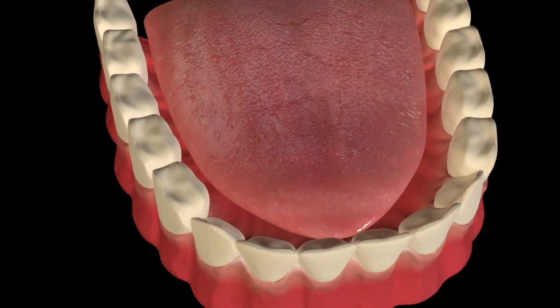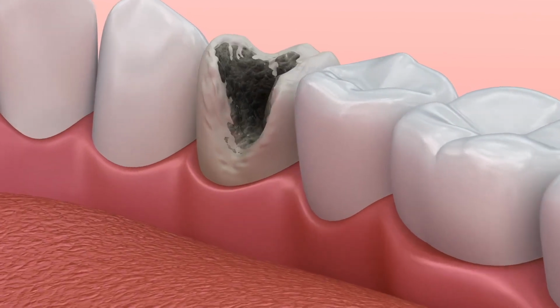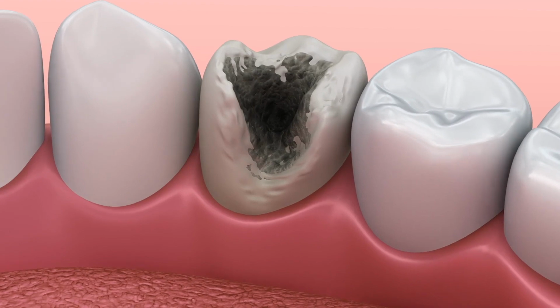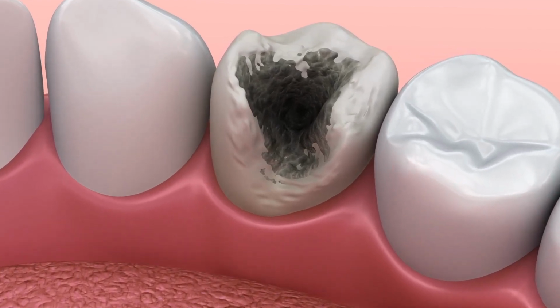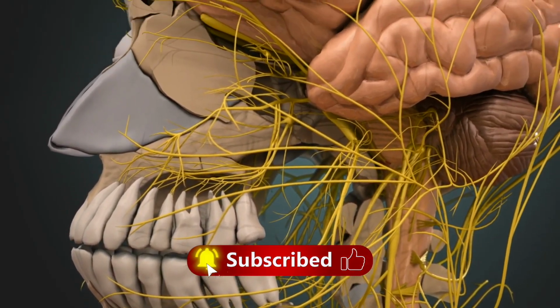There are several options for filling materials, including composite resin, amalgam, ceramic, and gold. Composite resin fillings are popular for their natural appearance and are often used for front teeth. Amalgam fillings are durable and commonly used for back teeth where chewing pressure is greatest. Your dentist will discuss the best option based on the location and size of the cavity.